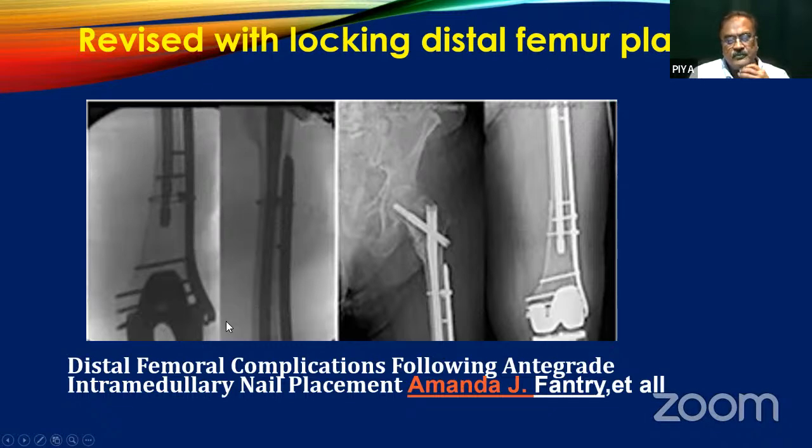And if at all you want to use a nail, it should reach the supracondylar area, and there should not be any bare bone like this. Otherwise, it will produce a stress fracture in an osteoporotic bone.